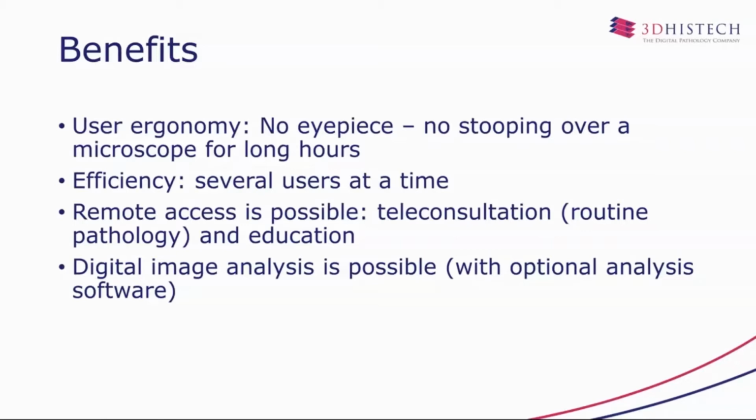Remote access is possible, which makes a lot of sense for teleconsultation, mostly in routine pathology and also for medical education. And last but not least, if you have an optional analysis software, digital image analysis is possible, so there's no need for manual counting anything like cell nuclei, for example.